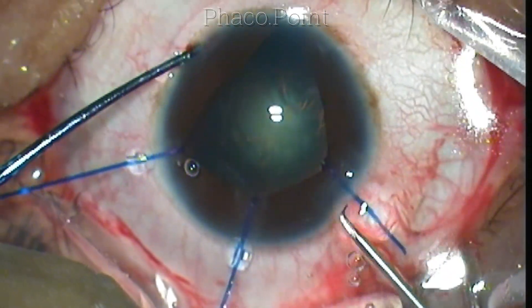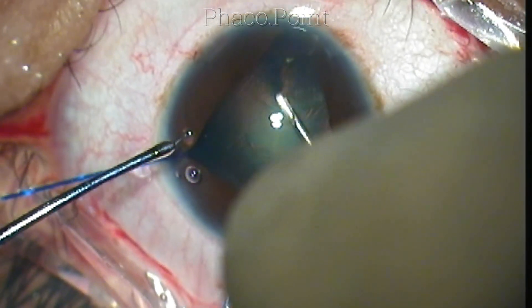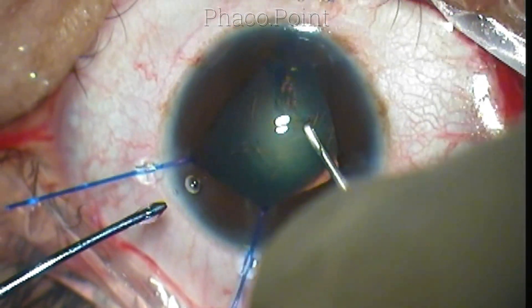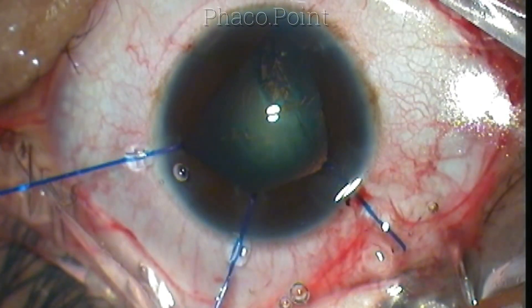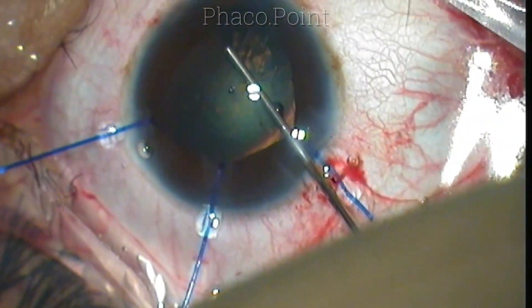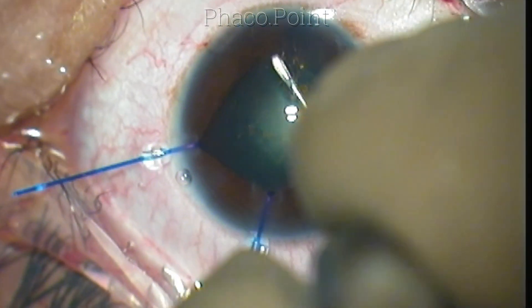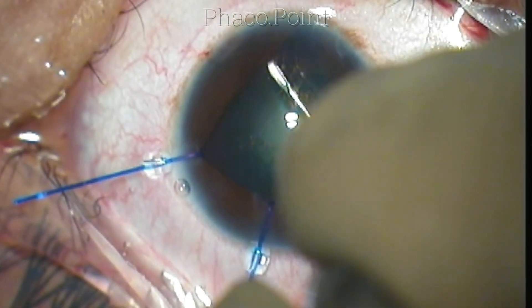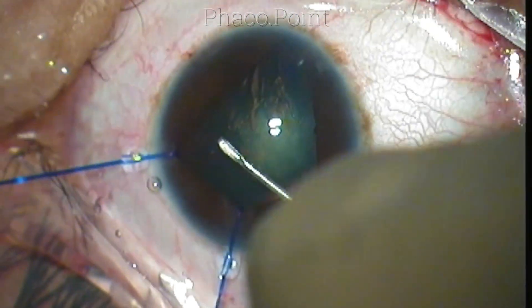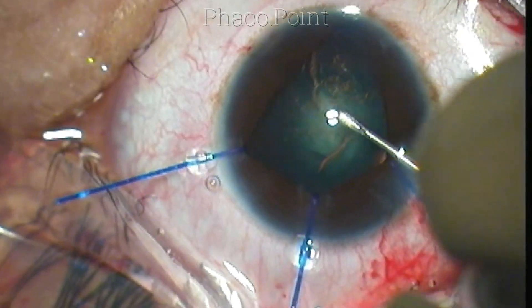Because Utrata forceps would further open the incision and shallow the chamber, I decided to try to complete the capsulorhexis using the cystotome itself. With multiple centripetal pull movements, I was able to successfully retrieve this runaway capsulorhexis and bring it back. Eventually I was able to complete the capsulorhexis, even though it was slightly eccentric. The successful completion of capsulorhexis is very important in these cases.